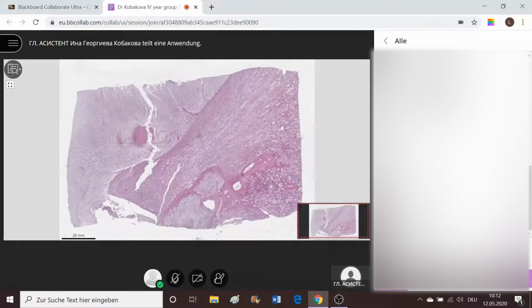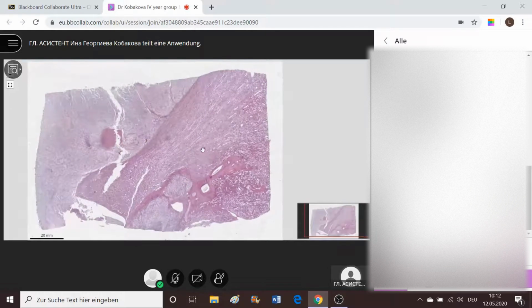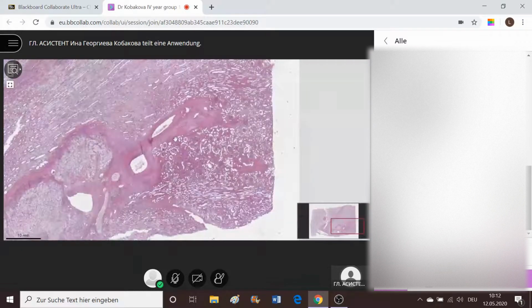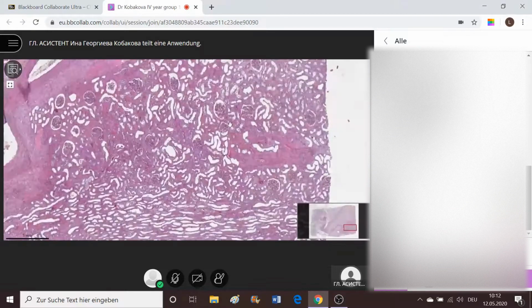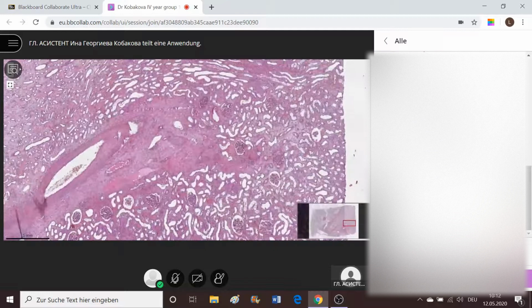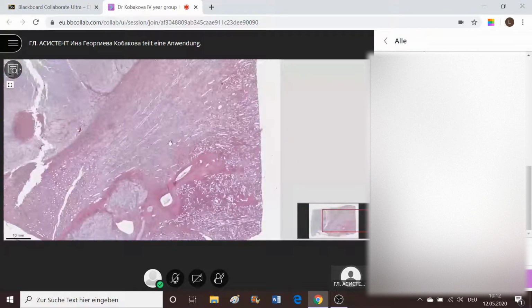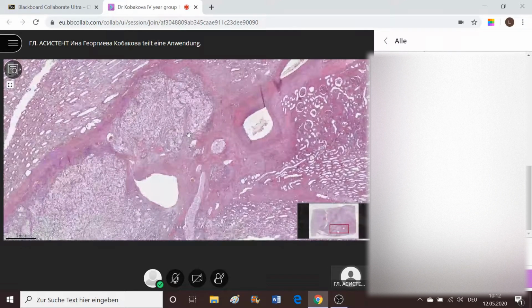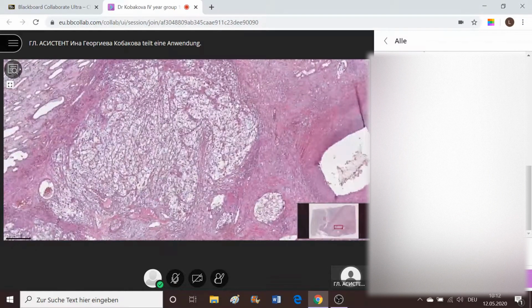What we should observe here are, again, kidney structures. They are a little bit compressed. As far as you can see, the tubules have changed shape because they are compressed by a volume process, which is right next to this field of the normal capillary structures of the kidney. So it starts a little bit here, this type of field which we should observe very strictly.